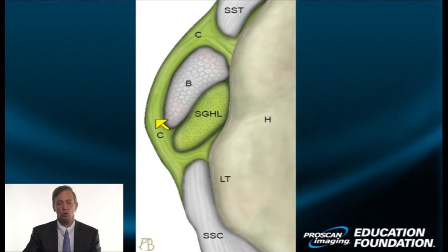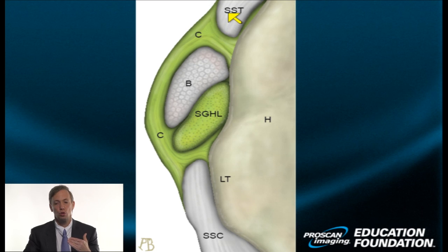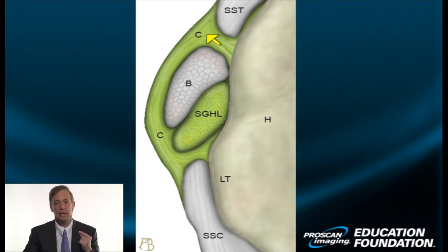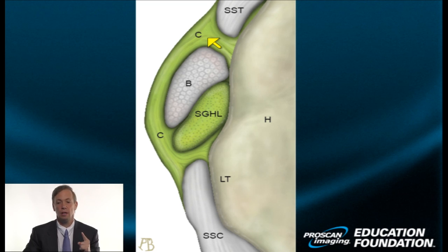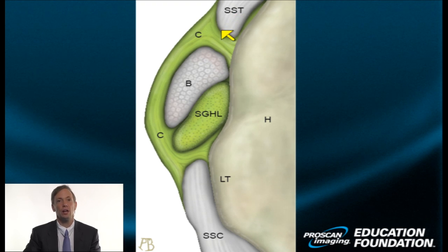The take-home message is that the coracohumeral ligament — a broad fibroelastic membrane — sends fibers along the most anteroinferior surface of the supraspinatus tendon, and these two blend together. So the coracohumeral ligament, shown in green, is part of the rotator cuff complex. It's not uncommon for tears to begin right here and then proceed either superiorly into the supraspinatus or inferiorly into other structures.